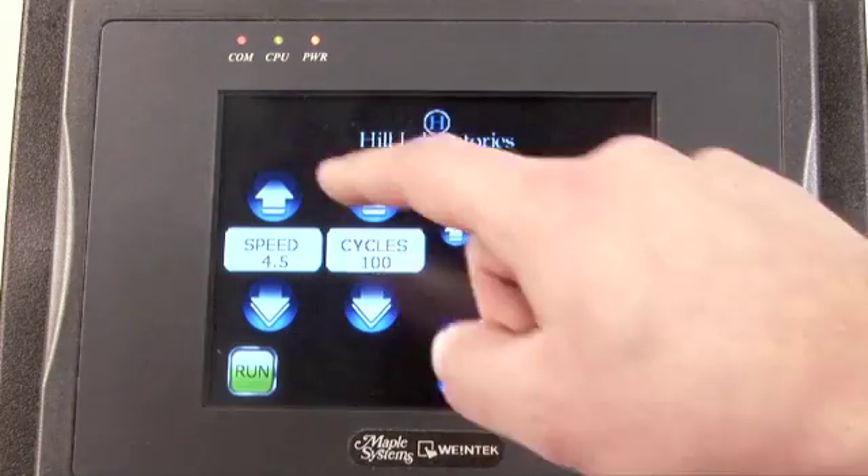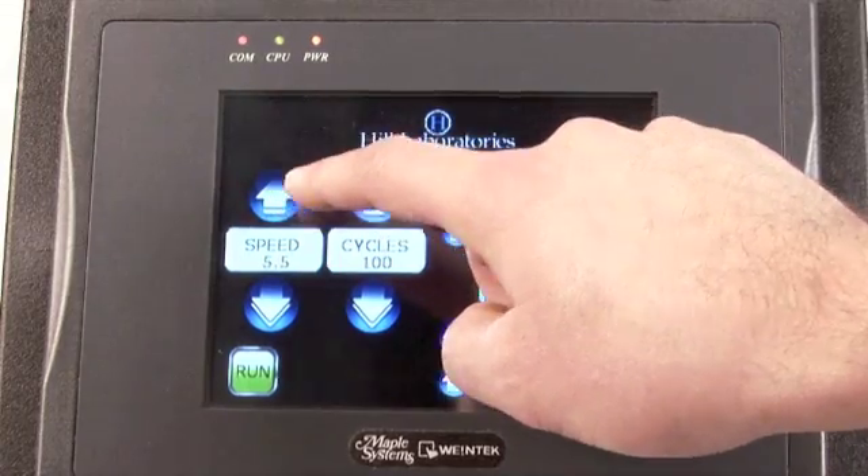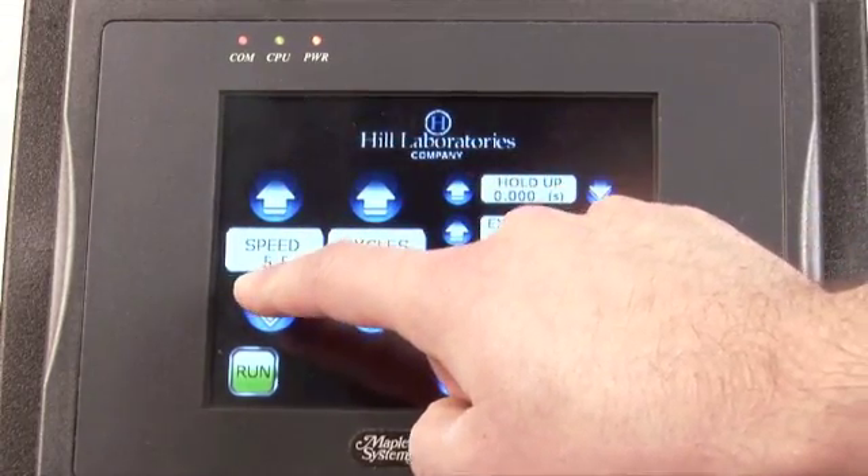Set the speed of the table motor using the up and down arrows. The speed setting ranges from 1 to 10 in half step increments.